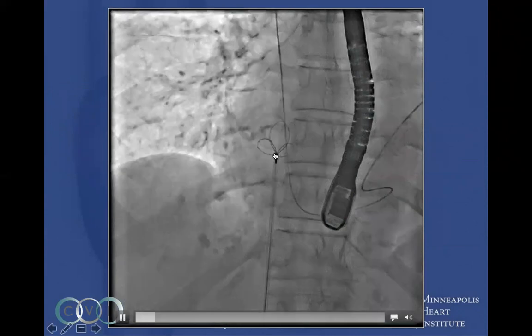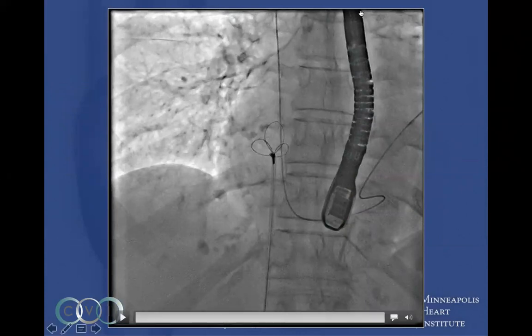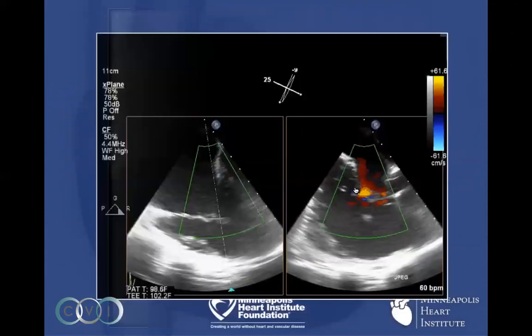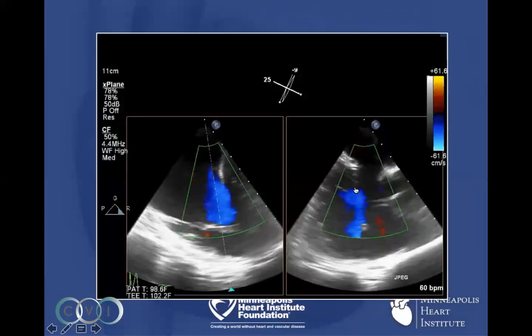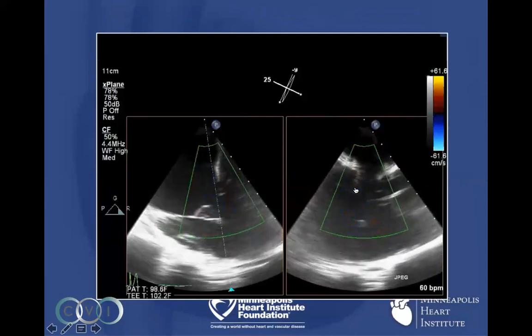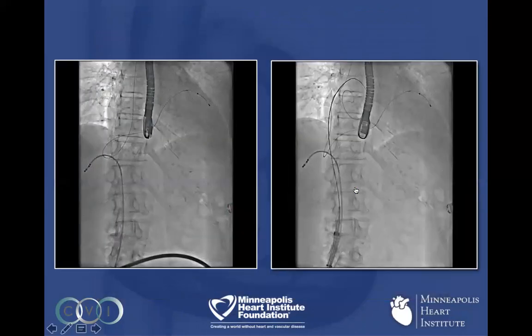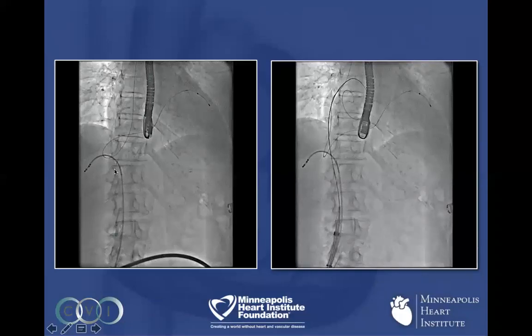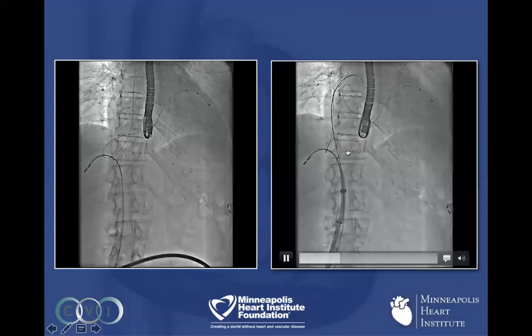We have a snare placed through the right femoral vein. We're taking the lead, which runs from the subclavian into the coronary sinus, and grabbing it to try to move it out of the way. From this echo, you can see that with moving the coronary sinus lead we've made it out of the way of the tricuspid valve. But not surprisingly, there's still a considerable amount of TR. With this information, we recognized it would be possible to treat this with transcatheter repair, so we mobilized the coronary sinus lead with a snare catheter coming up through the femoral vein, placing the snare around the lead with movement out of the way so we can advance a MitraClip device.